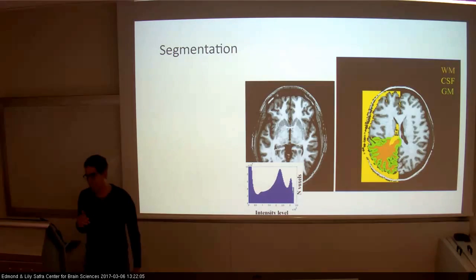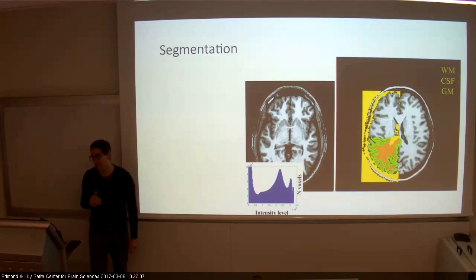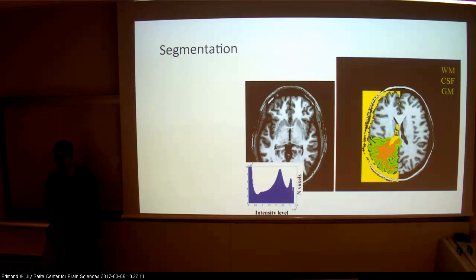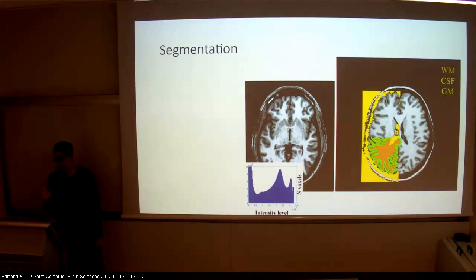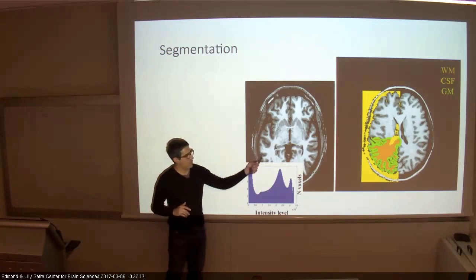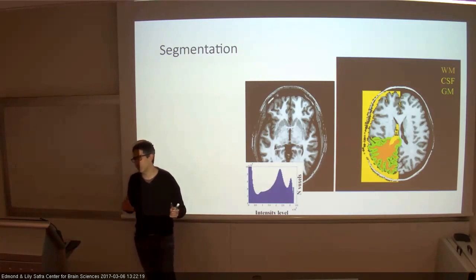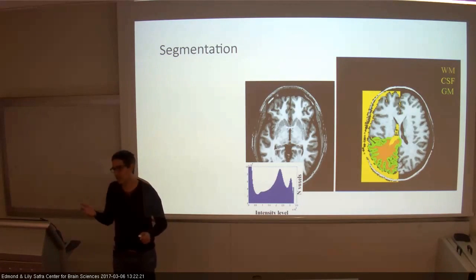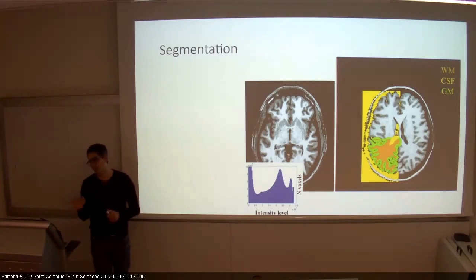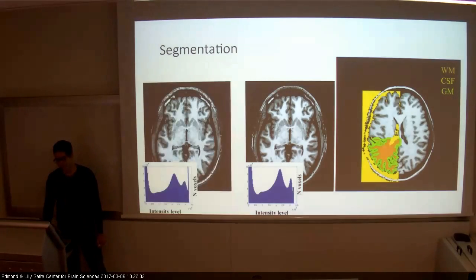This is for the study fixed white and gray matter, or the same thing? In here, I'm defining it as gray and white matter. It's actually important what you just said. In the end, what we're doing is looking at the fact that there is contrast, and I'm just separating a region with one level of gray values from other regions, which would have different gray level values. And I hope, in my mind, that this goes with gray matter, white matter, CSF. Some people forget that. They just hope.